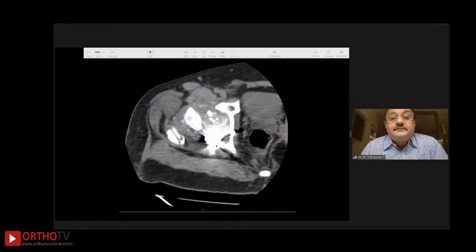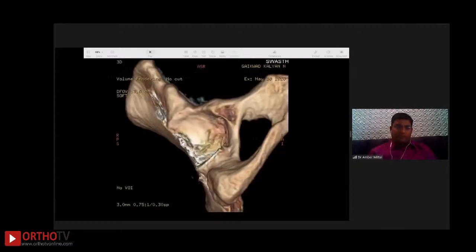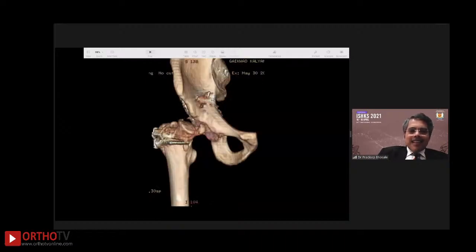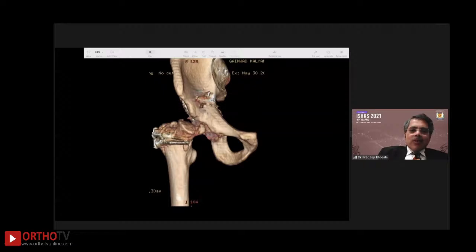So, the case is open. Pradeep? Can we see the previous CT? Sure. Yeah. Okay. Yeah, so you have wonderfully ruled out the infection. So, it's a clean case. Everything aspirated, good. Kept him again for 3 weeks without antibiotic, of course. Yeah. So now you can explore with good exposure.